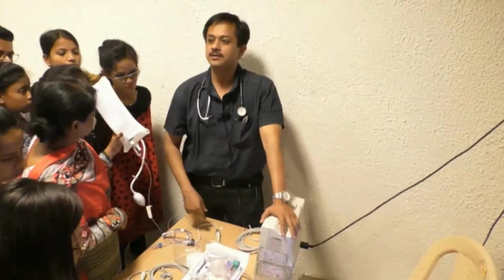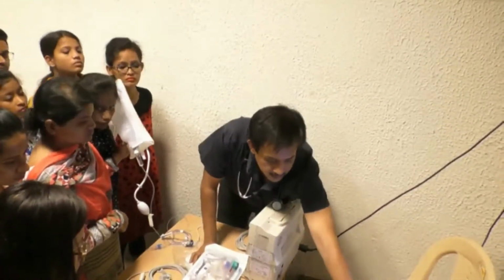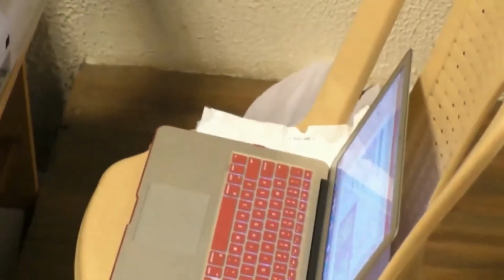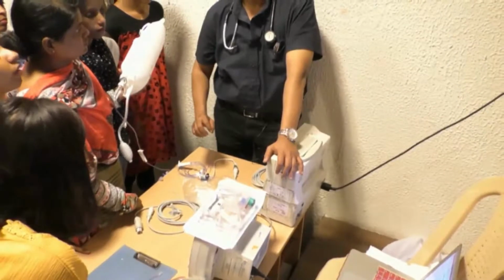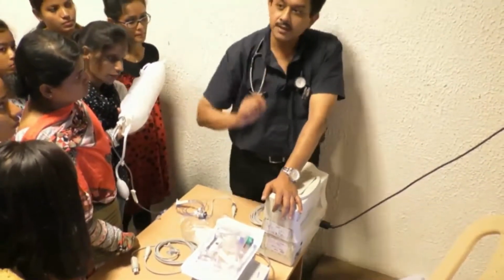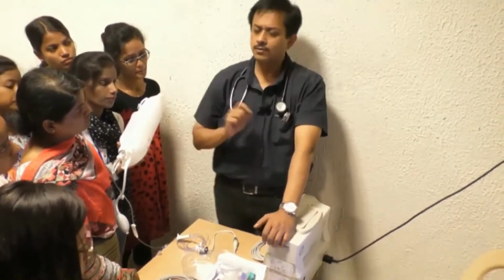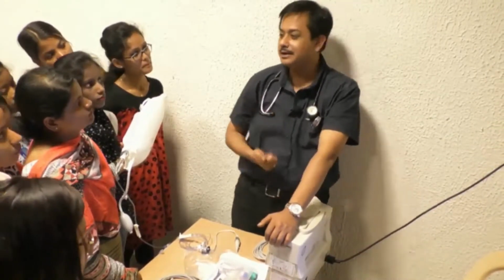This is an underdamped tracing. What happens is there will be more than 2 oscillations before it returns to the baseline. When can it happen? If the tubing is too stiff, if there is hypothermia, or tachycardia or dysrhythmia, this can happen. In that case, the systolic pressure will be more, but the important thing is the mean arterial pressure will remain unaffected.